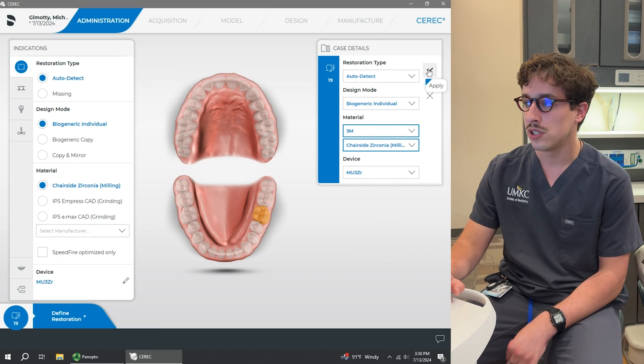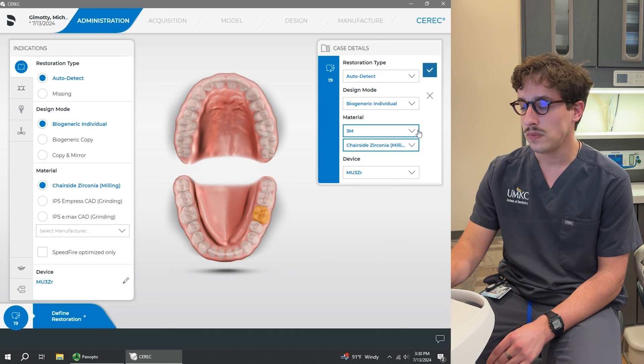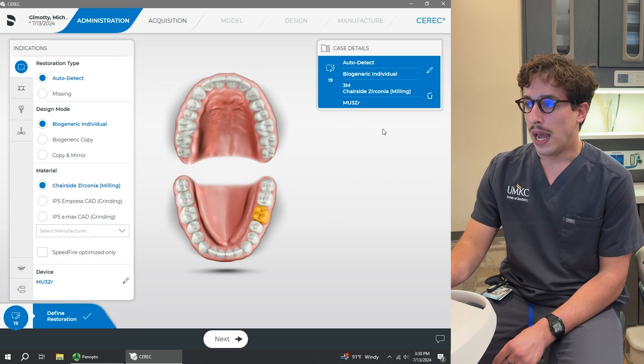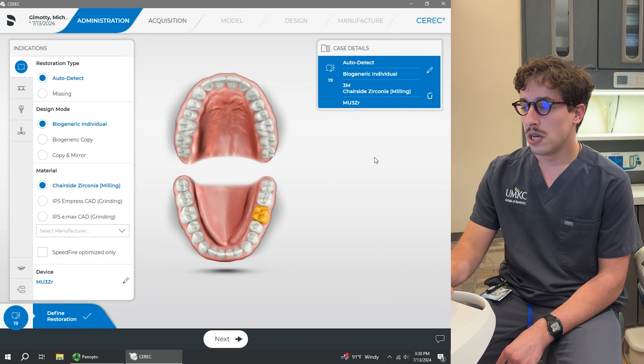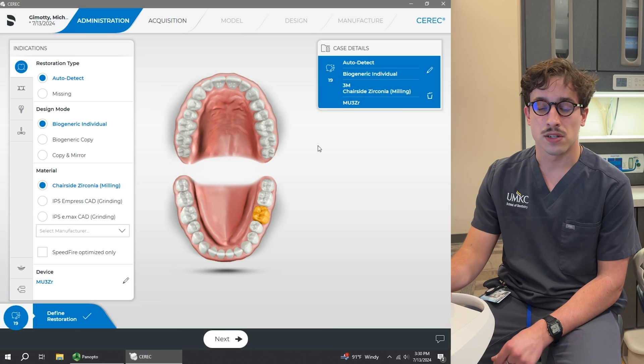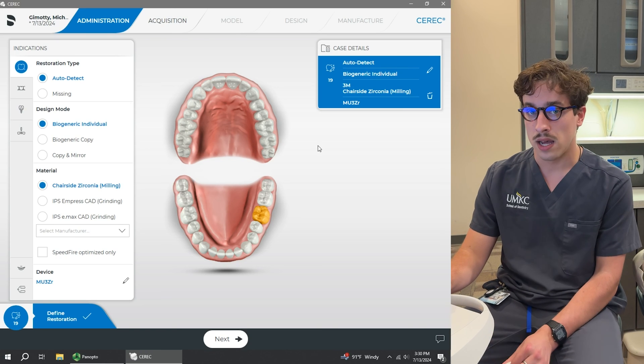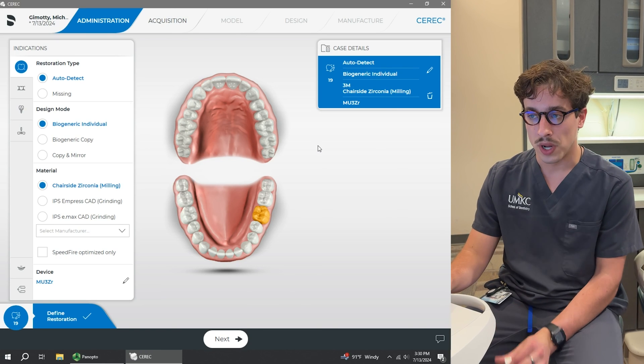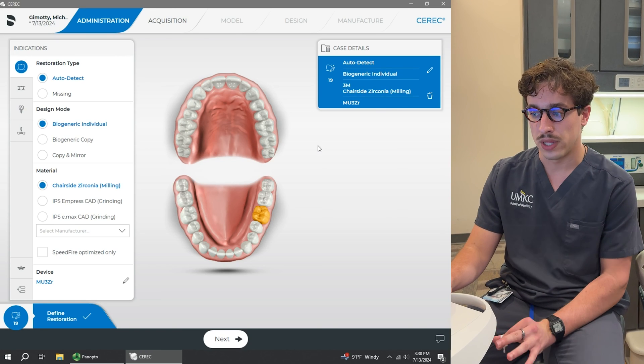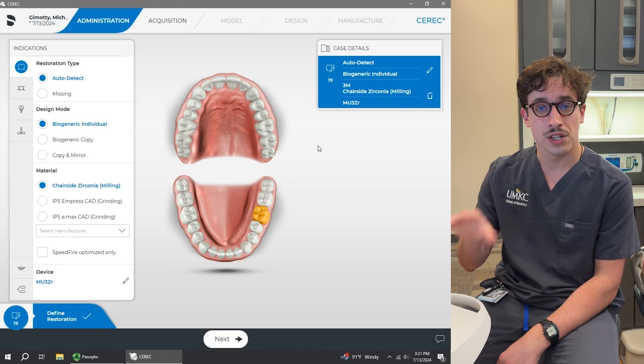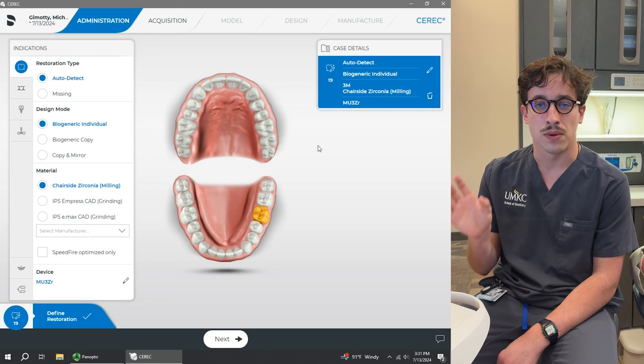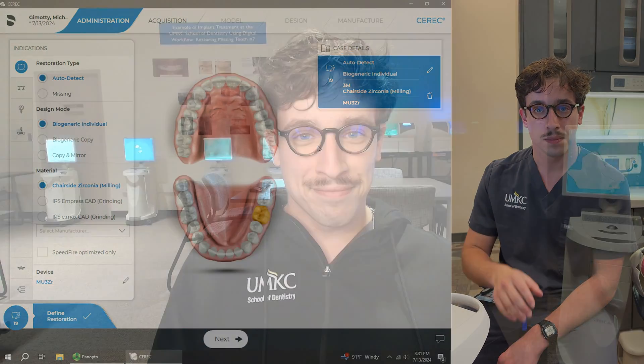So we made the correct changes. We're going to hit apply. And again, just always double check in this top right to make sure everything's correctly selected because if it is not, then we will run into issues later. So now that the administration tab is done, we're ready to move on to our acquisition phase.